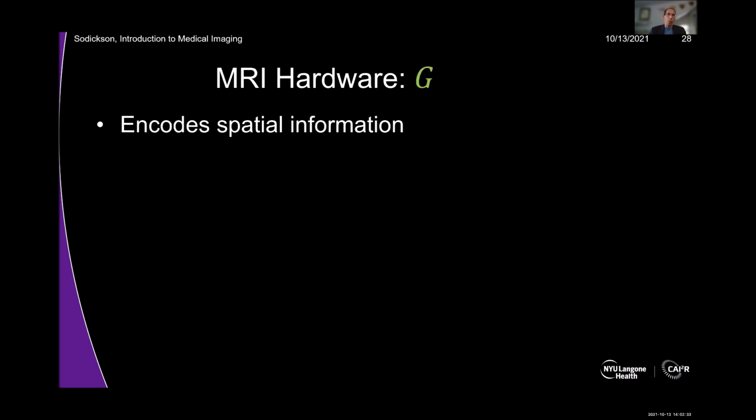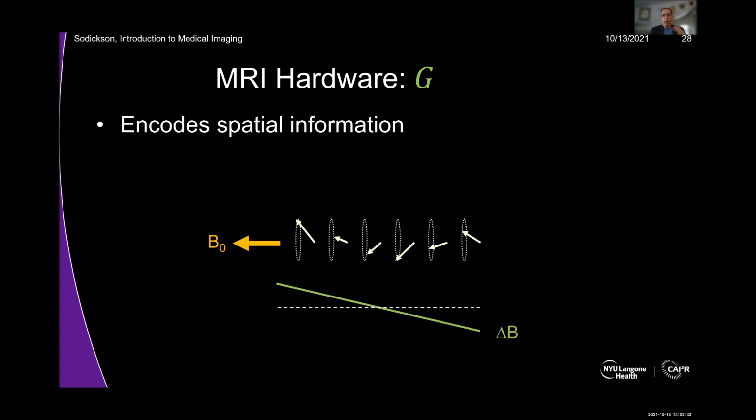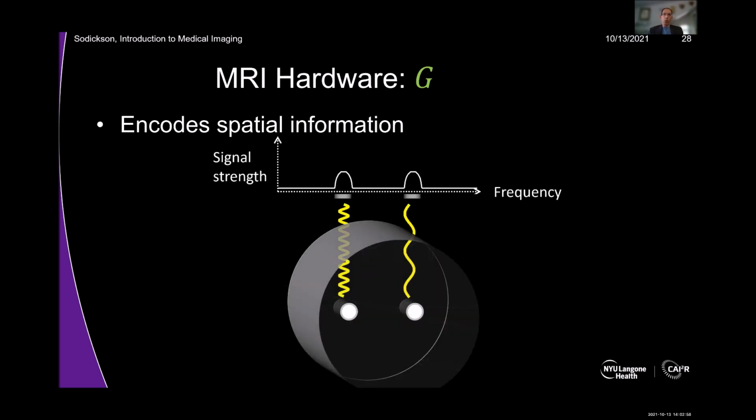And of course, that different way, I've already told you, is using magnetic field gradients. So if we have our spin precessing in the magnetic field here, if we put on now a varying magnetic field from one side to the other, the spins precess at different frequencies on different sides. That means that that direction, that spatial direction, is now encoded in the frequency. And this is how, with the Fourier transform, we can get the projection, as you already saw.